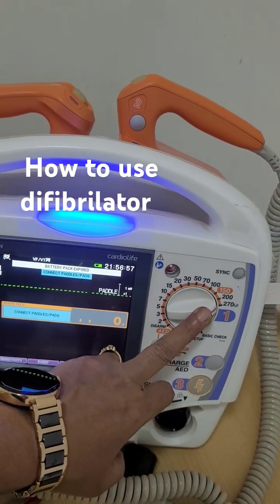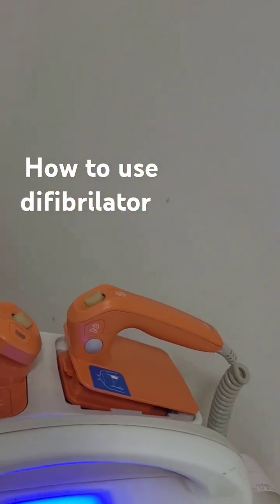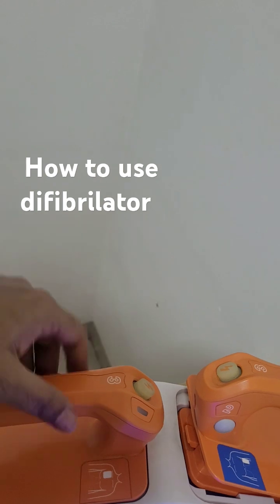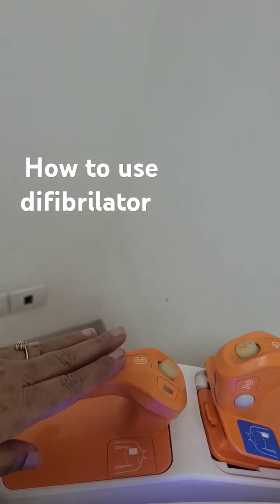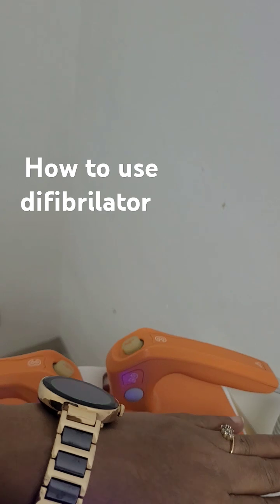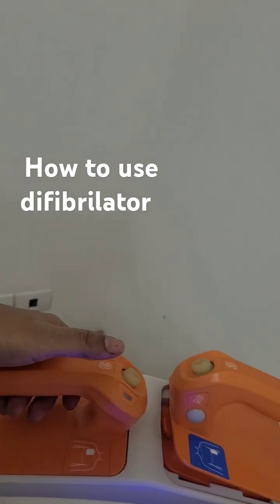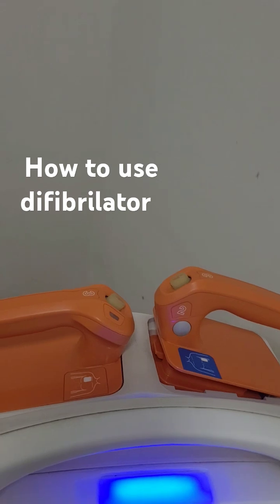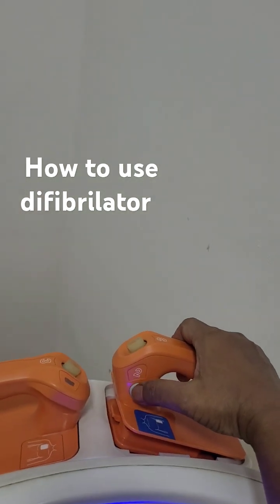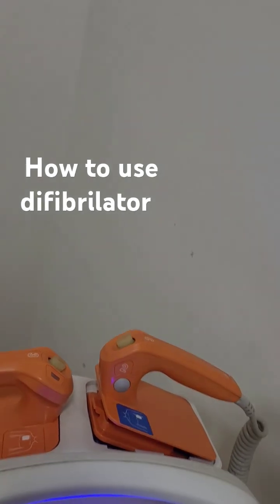Once you have selected the energy, you take the paddle off and attach it to the patient. The right hand paddle will be just below the clavicle and the left hand paddle will be just below the left nipple. Then you charge it - generally we charge it by our thumb only, by pressing these two buttons.